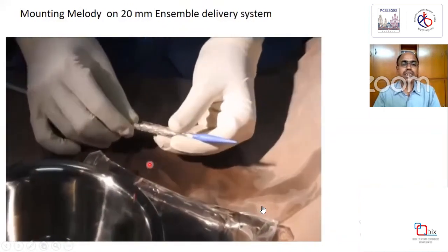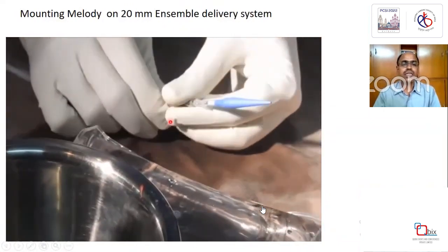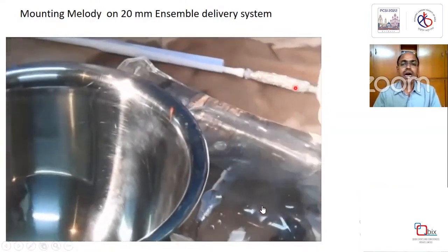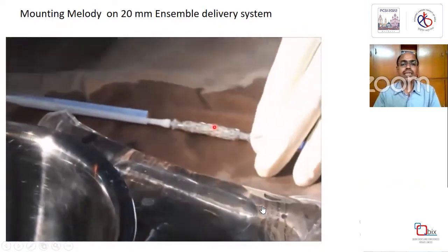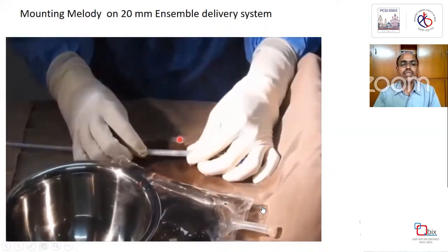So here you appreciate that the stent is being mounted over the Melody valve. This is the stent being crimped on top of the Melody valve, and the Melody plus the Andra stent is now getting sheathed by the Ensemble delivery system.